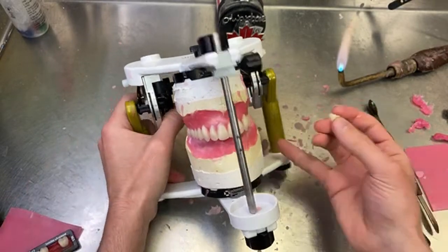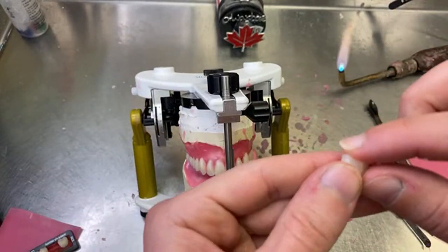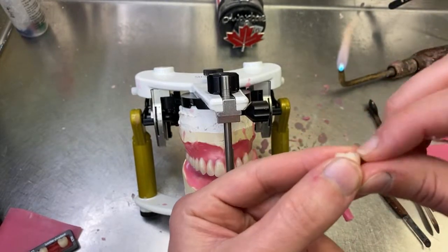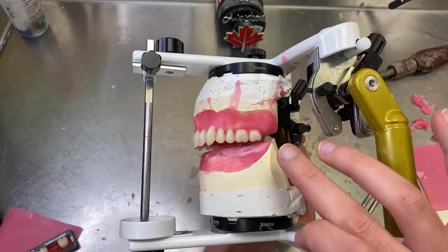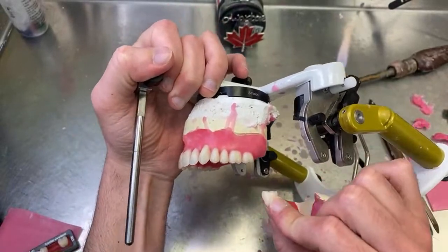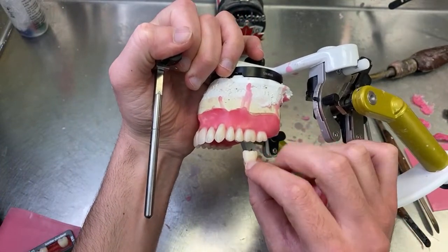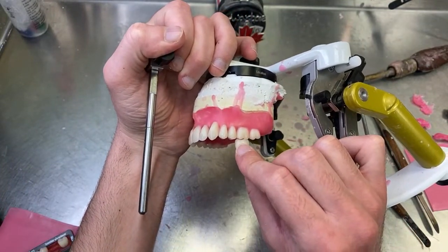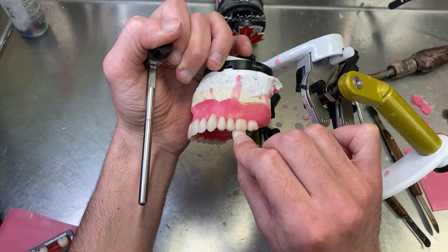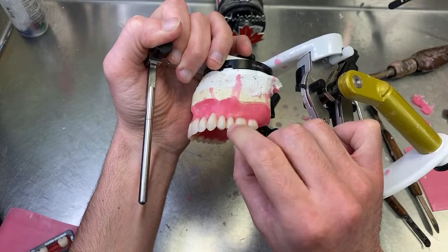Okay, a key thing here. So this is a lower. You see here, we have those three cusps. We have two lines, and we have three buccal cusps. And you look at the upper, and you see two. So when I'm setting the teeth here, what I like to do, which is how that type of tooth and mold should be set, is those three comes right in the middle of those two right here. And then when they slide, they'll be in balance. So you can't have them like this, you can't have them back here. It has to be right here.